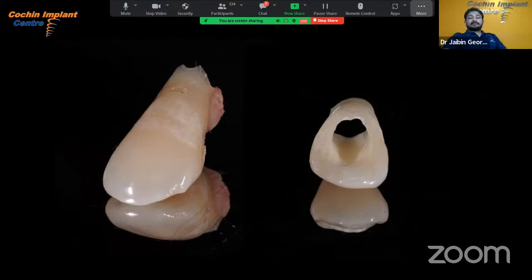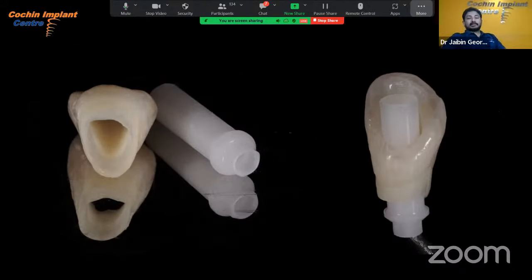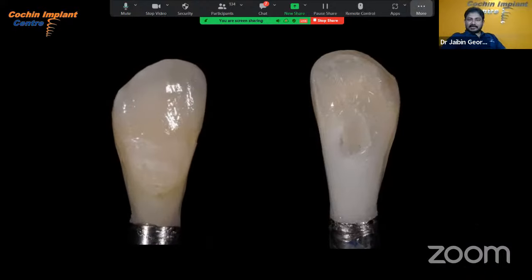In this case, we have used the patient's own fractured tooth. The fractured tooth we made as a provisional crown. We made a hole in the center of the fractured tooth and used a plastic abutment. These types of abutments are used for screw retained restoration. The castable abutment is bonded to the crown using flowable composite, and the provisional crown is made.